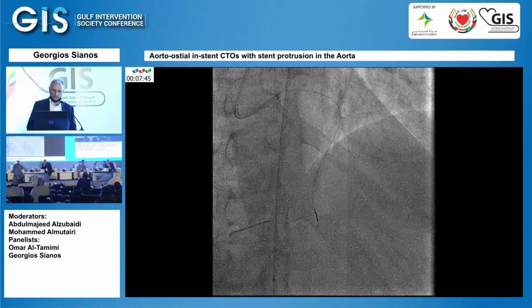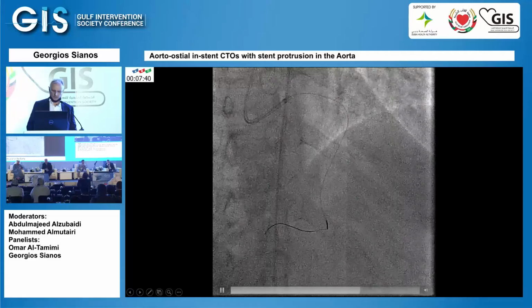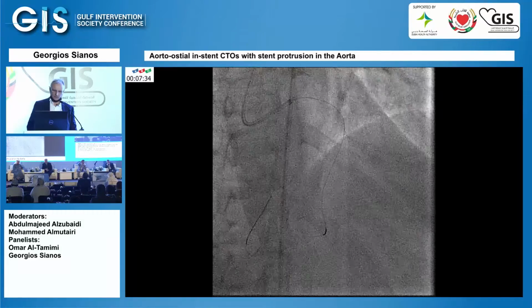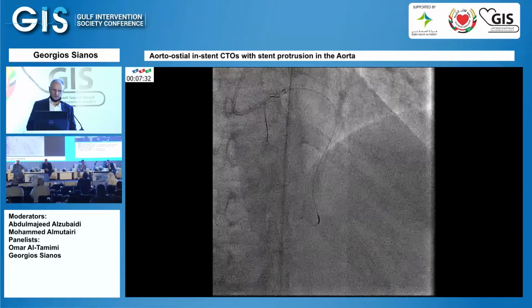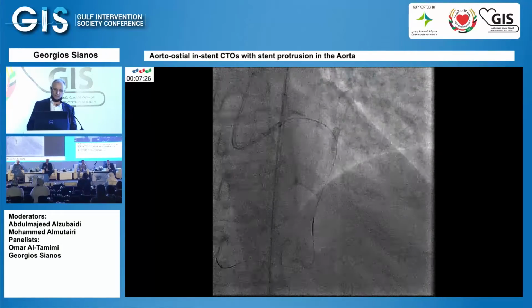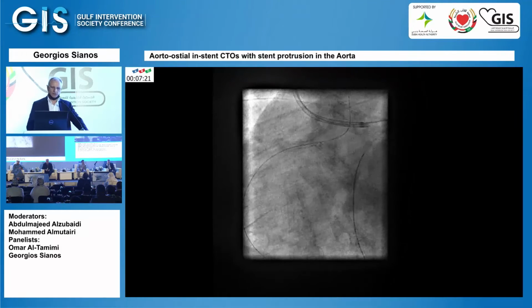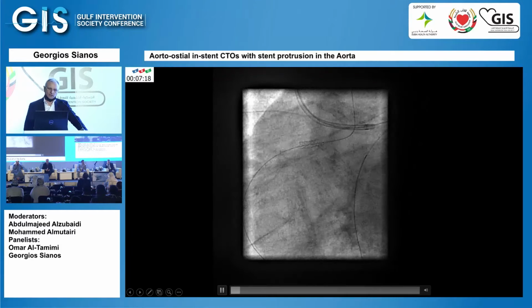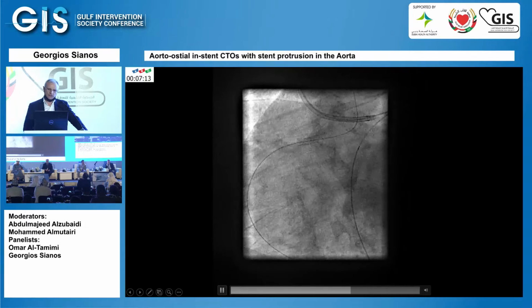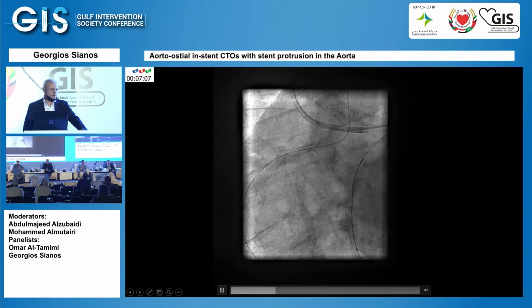And then LP, it reaches down to the point of the connection to the right coronary artery, but over there was a lot of resistance. The wire was coming back, and while the wire was coming back, we pushed it, and you saw that it crossed into the aorta. So the occlusion was quite short. Another very interesting thing, and that's part of presenting the case, is that you see that the wire goes through the occlusion of the stent. It was a short stent anyway. You see the deformation from the previous angioplasty, and you see that it goes through the struts.